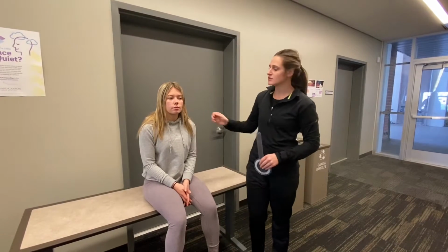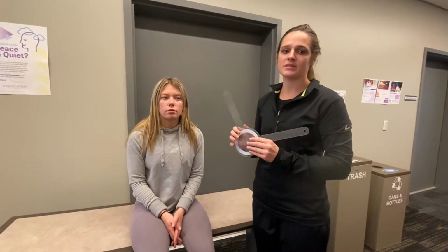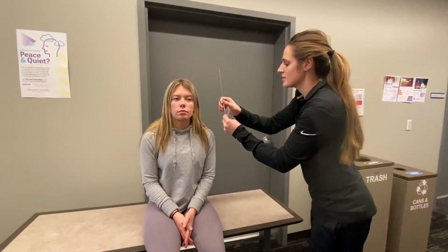Hi, I'm Francis, and today we're going to be doing spine range of motion, cervical extension. The axis of rotation is going to be the external acoustic meatus. The stationary arm is going to be perpendicular to the ground. The mobile arm is going to be aligned with the bottom of the nose.